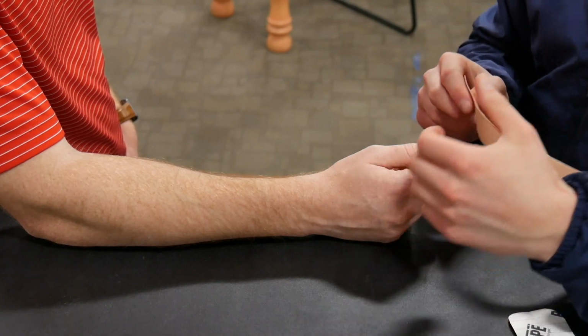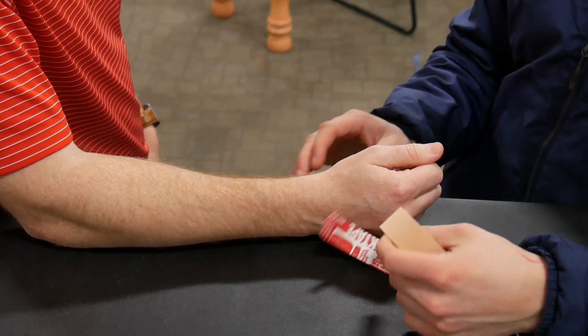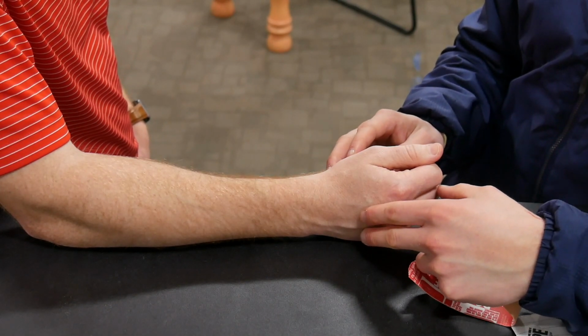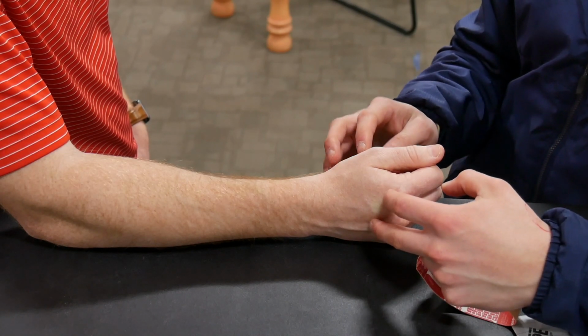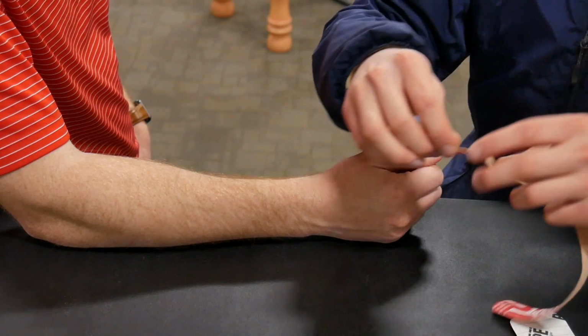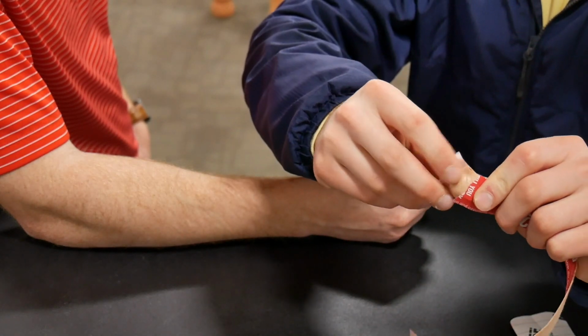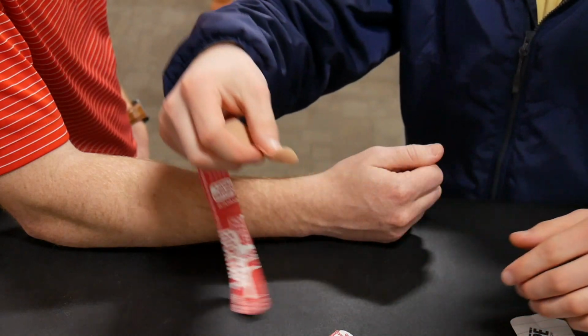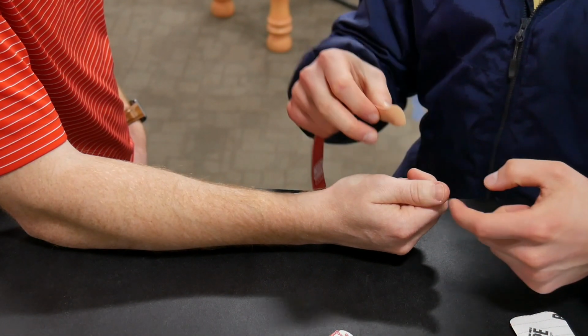So your patient should be in about 90 degrees of elbow flexion or somewhere close to that. Have them forearm neutral and have them in just neutral as far as radial and ulnar deviation. Their thumb is at rest. You want to take your longer strip of tape, which is 1 inch wide. Again, you're going to tear the paper off one end to give an anchor point. You're going to anchor the first piece of tape just proximal to the nail, right at the nail bed area.